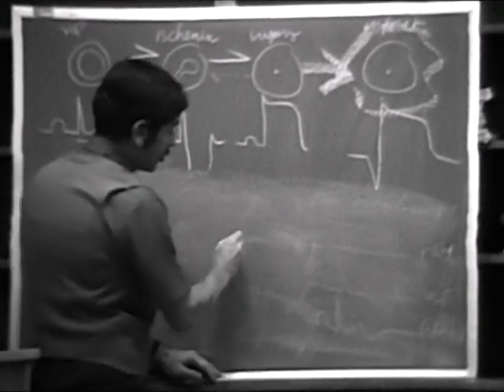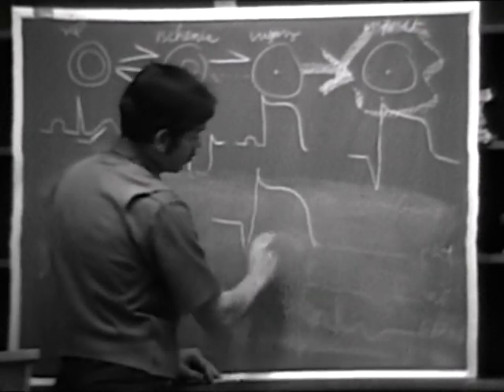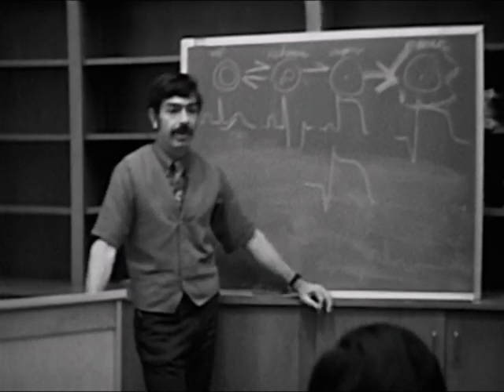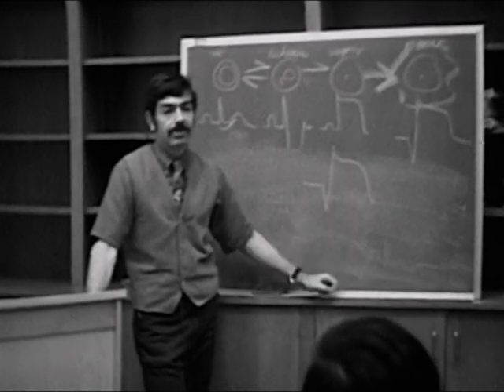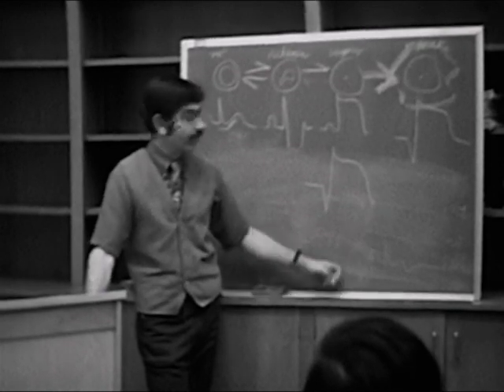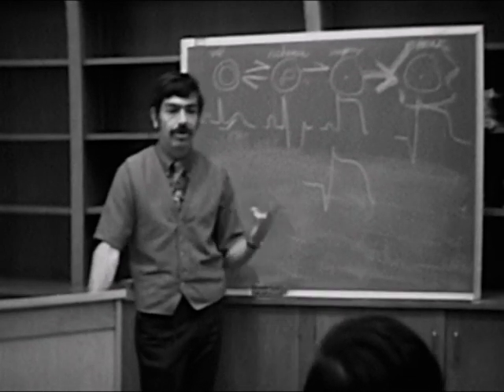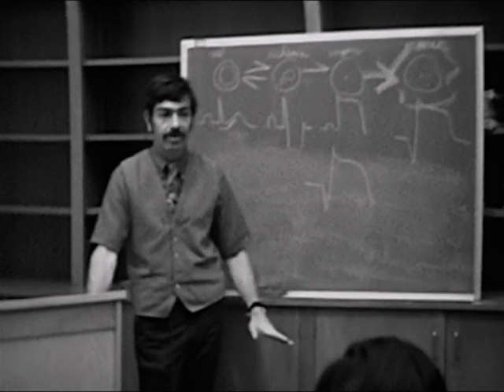Well, what I'm saying is here's a patient, he's had an infarct, right? He's a week after the infarct, it looks like this, and then you look again, send him out of the hospital after his appropriate rest period, and then he comes in 6 months later and he still has that. What do you think of? I mean, you don't think that he's had something active going on all that time. Oh, it's possible. Aneurysm, ventricular aneurysm. Okay, that's the third cause of ST segment elevation that you should keep in mind. Pathologic cause.